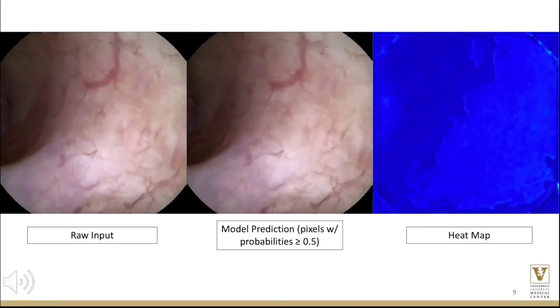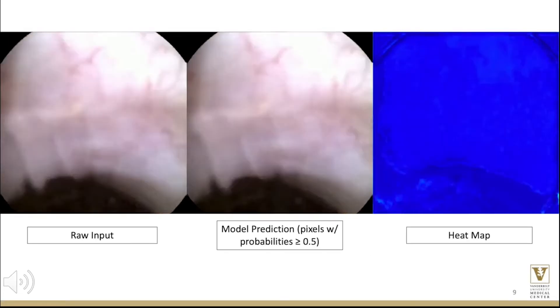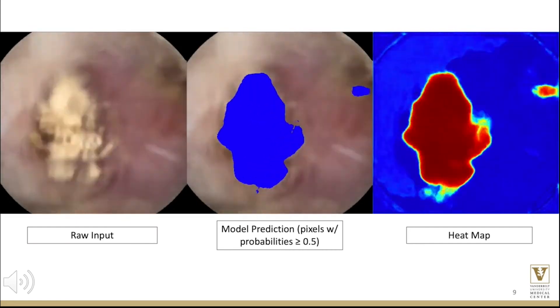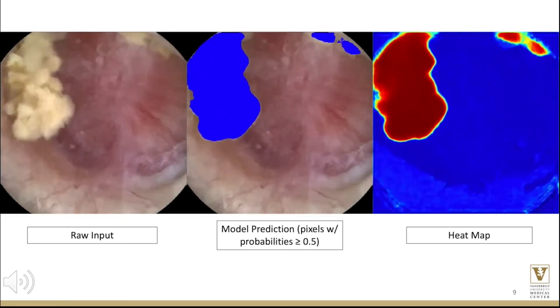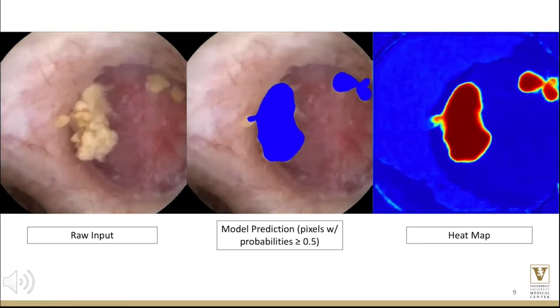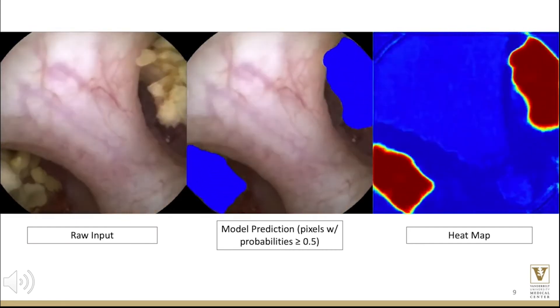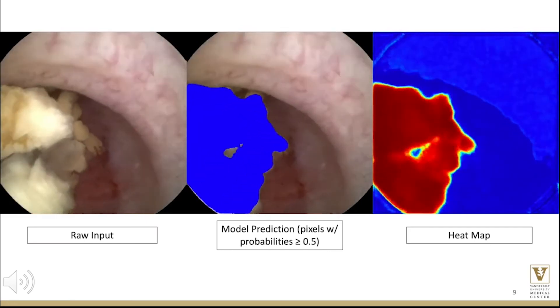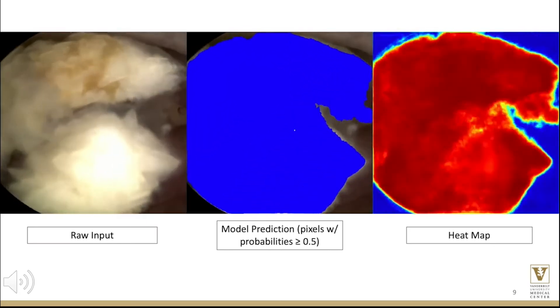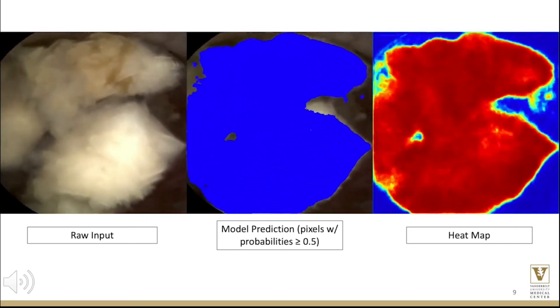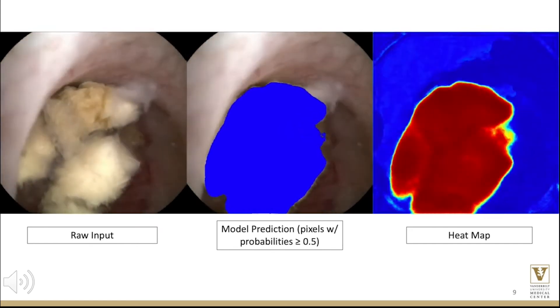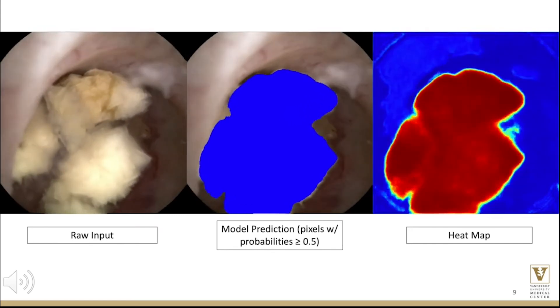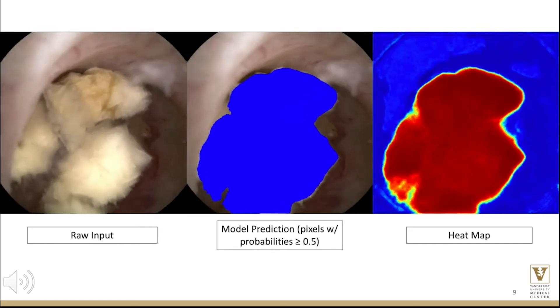In this video, you can observe raw input on the left, model prediction in the middle, and a heat map on the right. The model prediction segments pixels with probabilities greater than 0.5, while the heat map illustrates the raw probability output per pixel, with red indicating a higher probability.